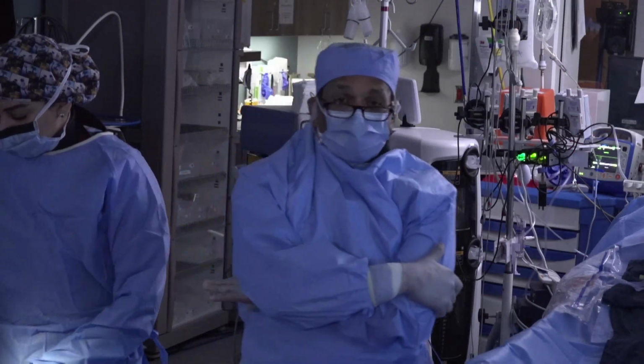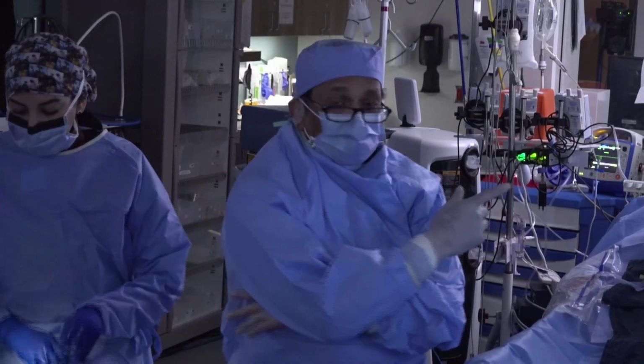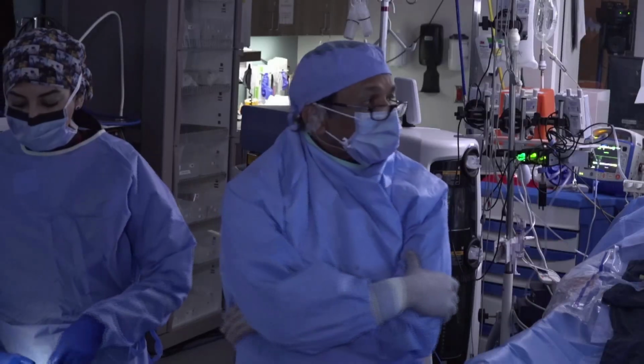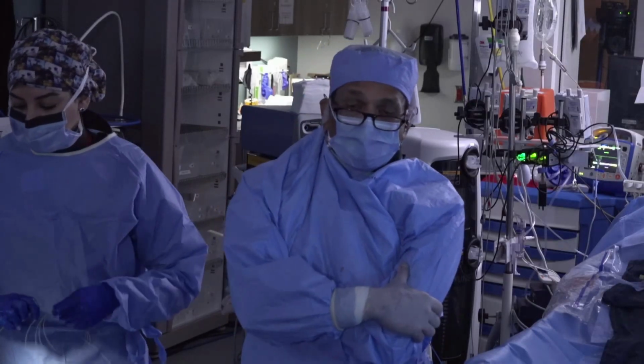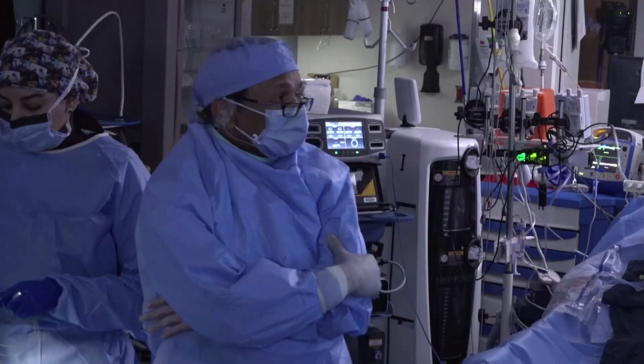Okay, so having said that, I'm going to just present the live case that we're doing. I have Stephanie Wilson, who's our nurse practitioner, and she'll go through the details of the case. And then while I'm working, we can go back to some of the lectures and hopefully stay on time.